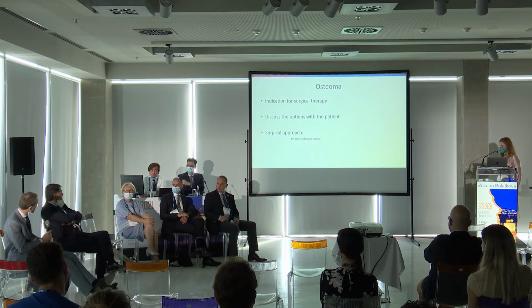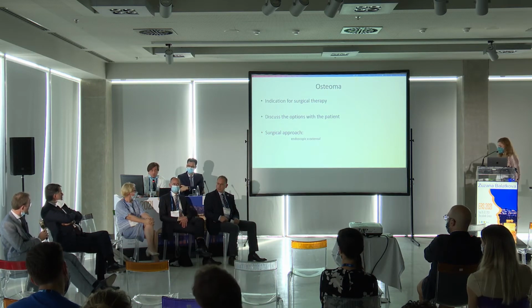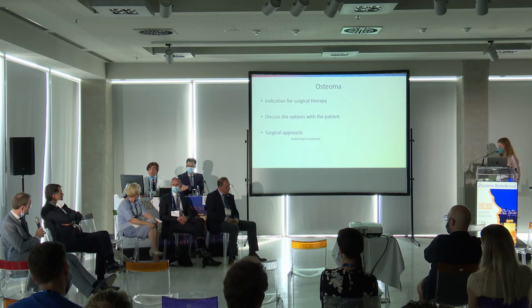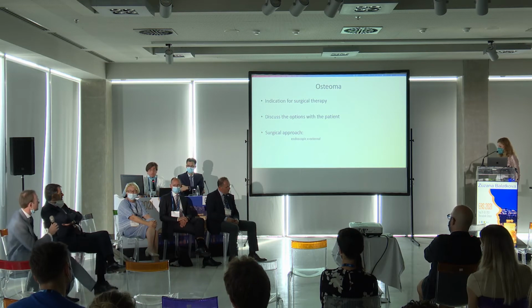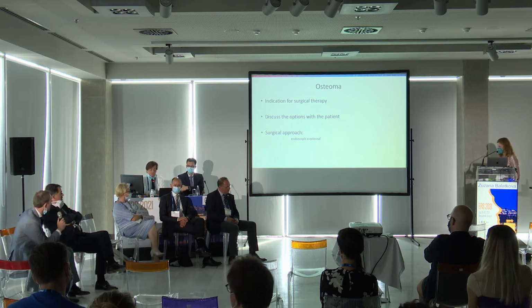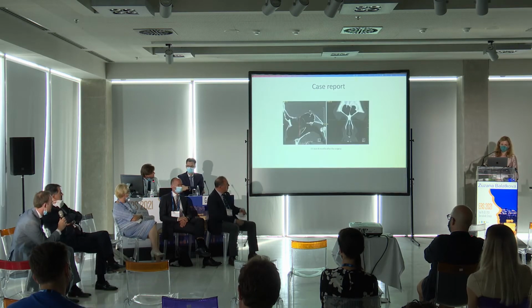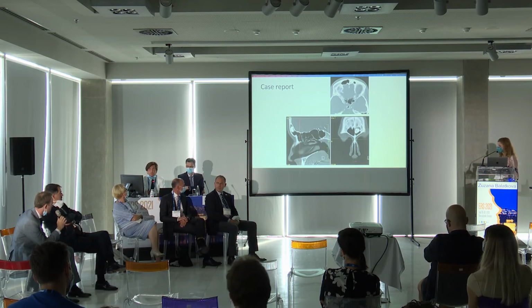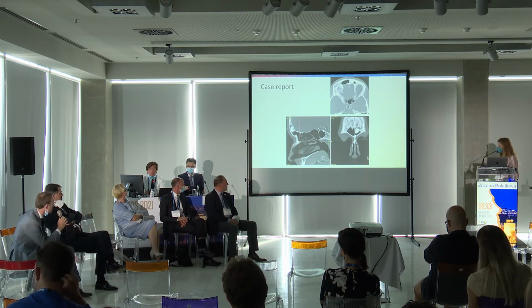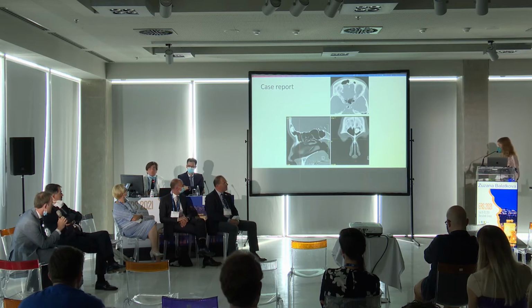Gwijde, how do you judge whether or not it will be possible to reach endoscopically? Because if you go back to the sagittal image, it's quite a distance you have to overcome from the anterior nasal beak. Do you use some kind of landmarks, or do you have something in your mind that you say beforehand I can judge whether I could reach it or not? Maybe you could go back to the sagittal. The thing is, you would really like to have all the images. If you look very carefully, with 0.5 millimeter slices, you probably can find somewhere where it's attached. It was attached medially. Medial, so that's even better.